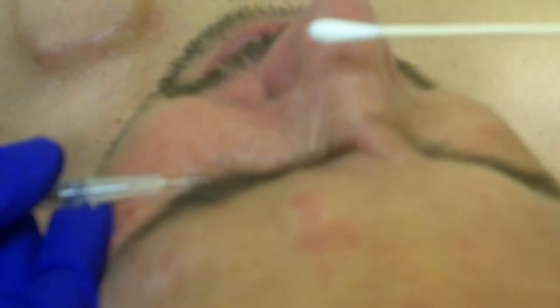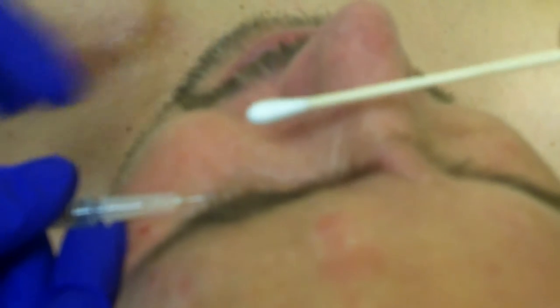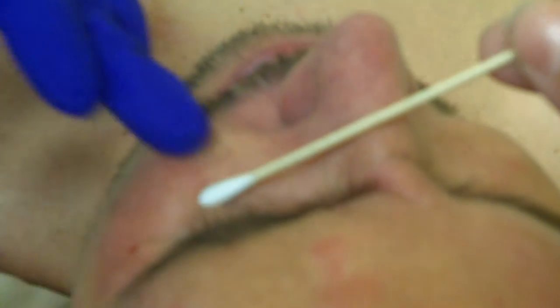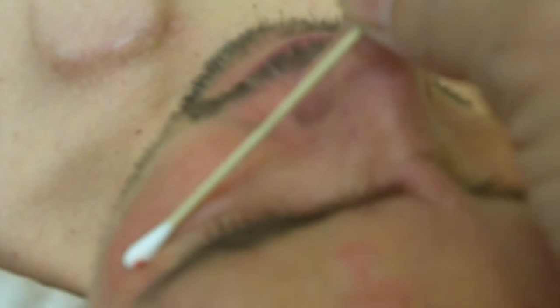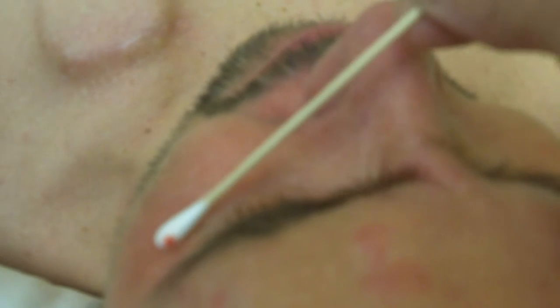Bring your face this way. One, two, three. Don't squeeze. Hang in there. Open up your mouth. Breathe in. Breathe out. Well done. You okay? I'm going to give you one more over here because I couldn't get the full dose of it, but I want you to have it, so hold on. One, two, three. Good job.